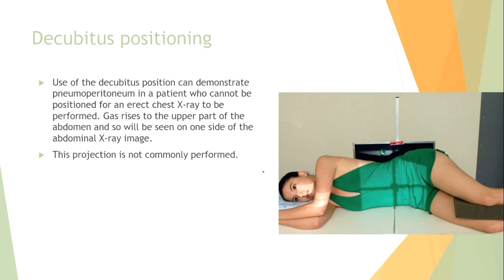Sometimes when we expect perforation from the patient, but if we want to see the circle sign, we must ask a patient to stand still. But some patients cannot stand still. This is most of the patients with palsy. So we can use decubitus positioning.